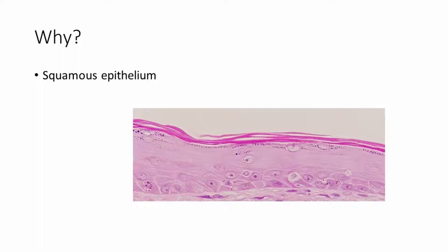The picture shows the squamous epithelial lining of the skin. It has multiple layers of cells, with the uppermost layer showing keratinization — it is the most pinkish layer on the top.